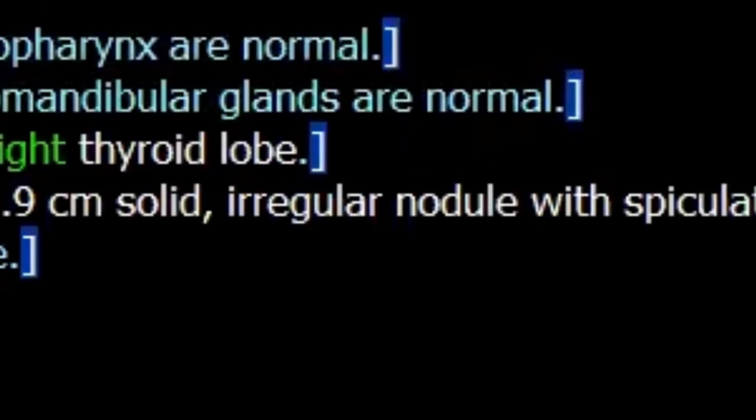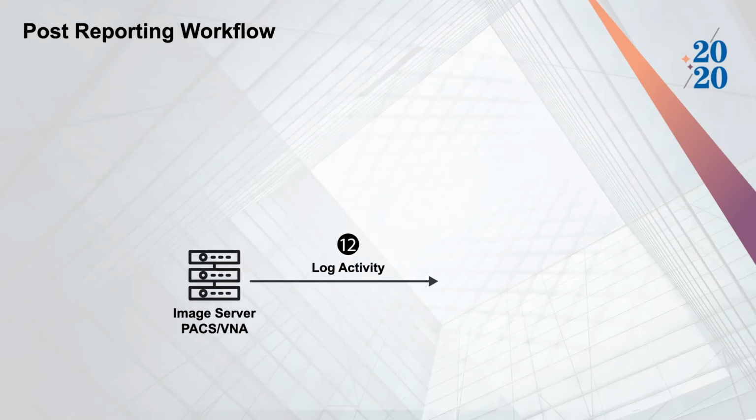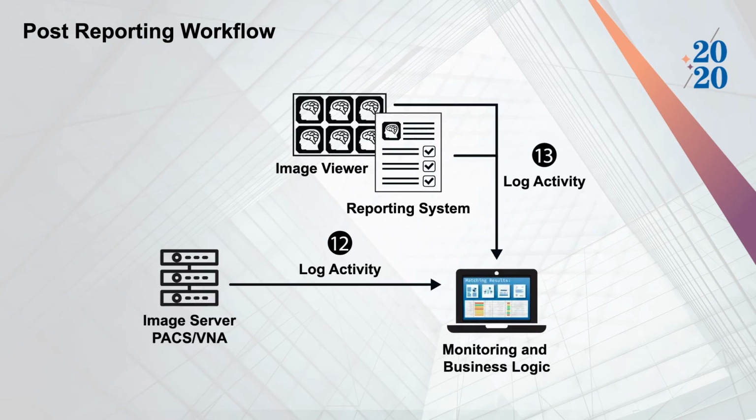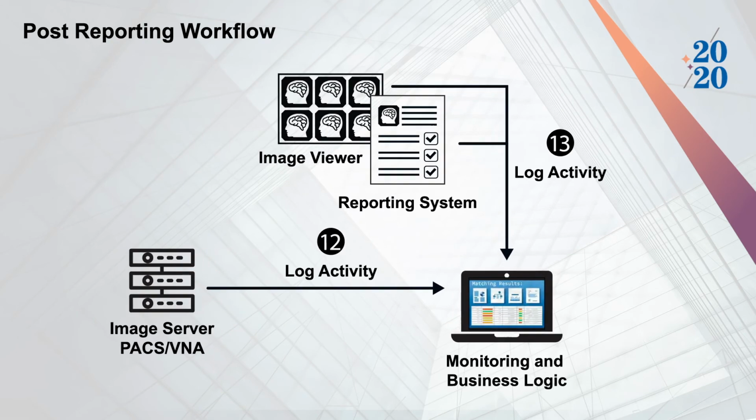And it streamlines future AI algorithm development by providing structured data to assist data scientists in evaluating the performance of the algorithm, which will then guide decision-making for future algorithm improvements. So how are we going to keep track of how effective AI is in our daily practice, or if anyone is even really using it? How will departments be able to justify investments in AI technologies?